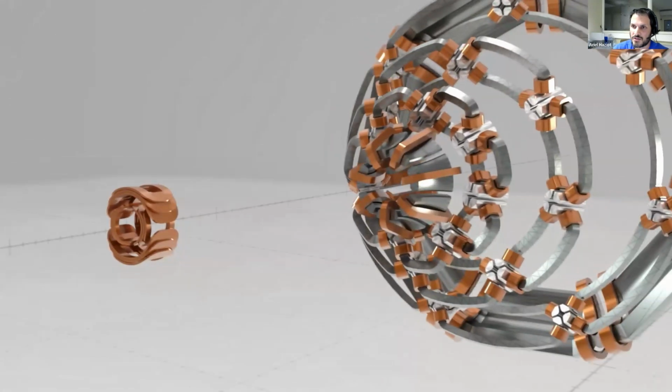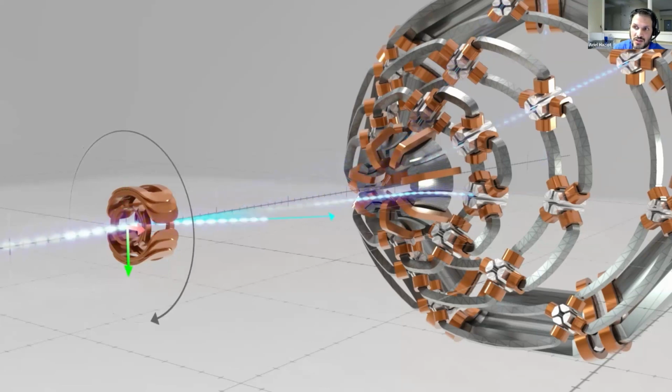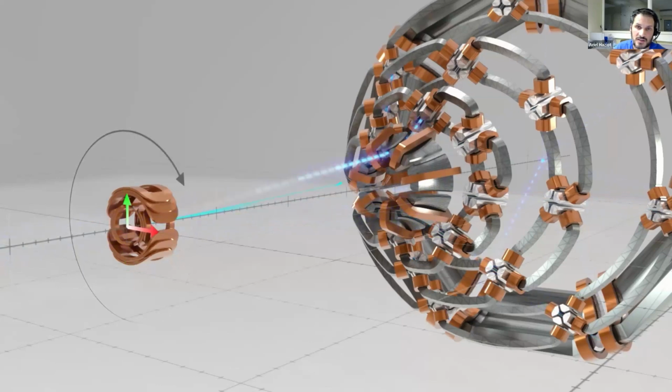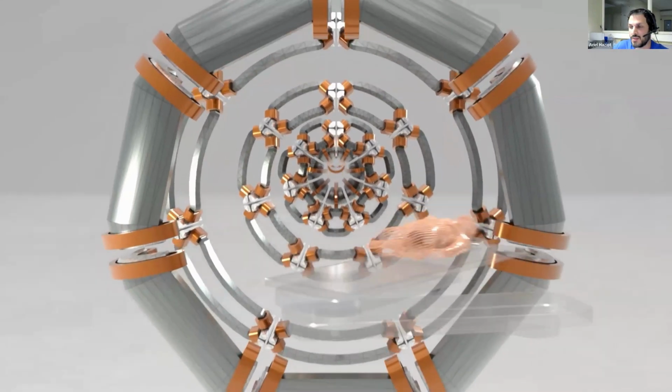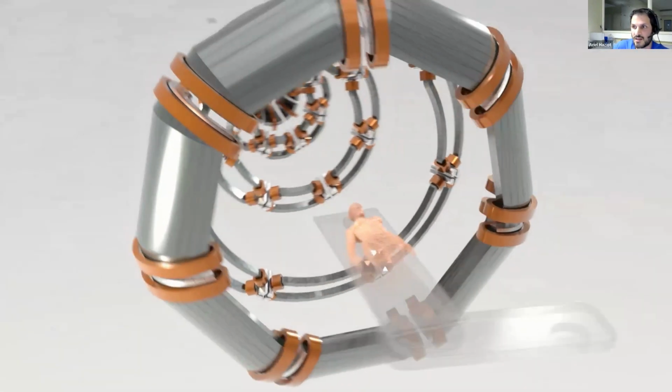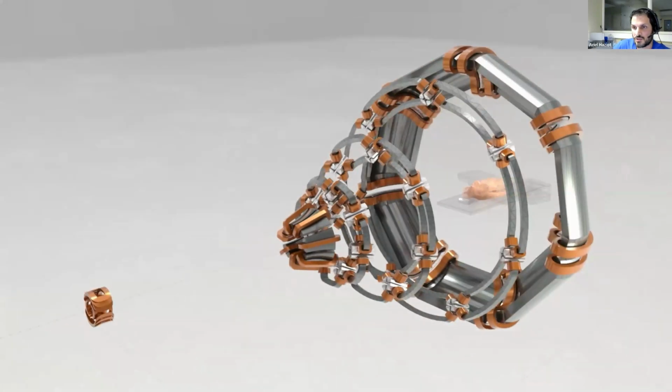And the vector magnet is also a big innovation in the system because it's not moving. It's a rotating magnet that is always rotating. And then the beam shots are synchronized with the direction that we want to obtain. And this rotation is very fast, so we can very quickly have different directions. And as you understood, the patient is placed in the middle of the bore of the bending magnet and then receives the beam from the different directions that are necessary for the treatment.